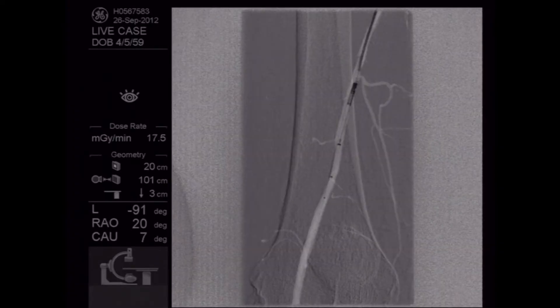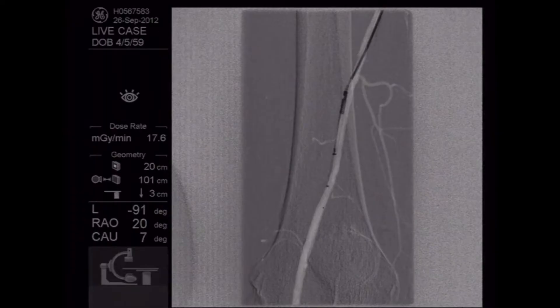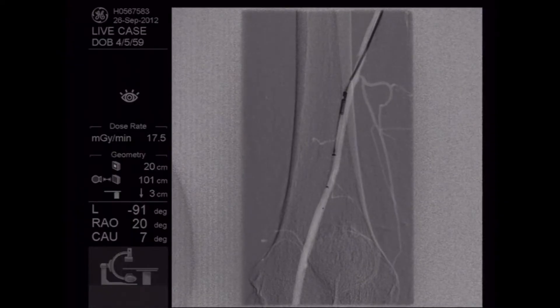Let's just show that again. This is a directional device, so we look like we have some narrowing there on the lateral part of the vessel. Dan, will you activate that for me? We're going to go ahead and take it right down through there slowly, focusing on the lateral wall of the vessel. Let's do maybe one more — we'll turn very slightly. And the lesion is completely gone. It looks like a normal vessel at this point.